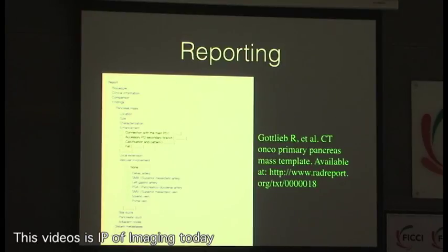And lastly, there is a structured reporting template available in case you are not doing a lot of these and you want to go systematically, or you are doing a lot of these and you want to be more systematic in how you report your scans. These templates are all available on the net, and this is one I've downloaded for you, and you can go and talk about the pancreatic mass, location, size, characterization, enhancement, connection with PD, accessory PD, calcification, etc.